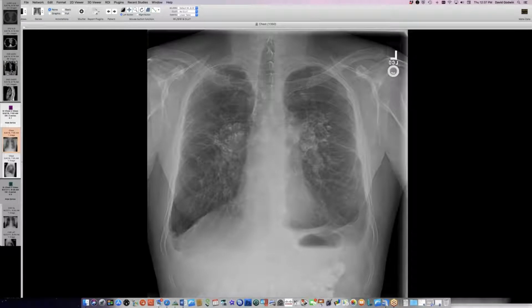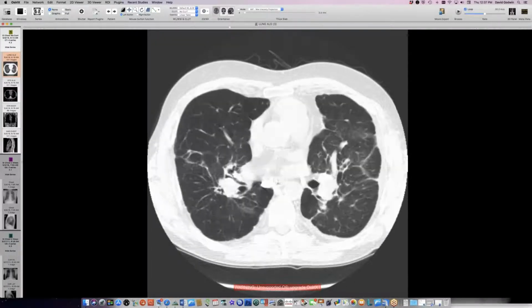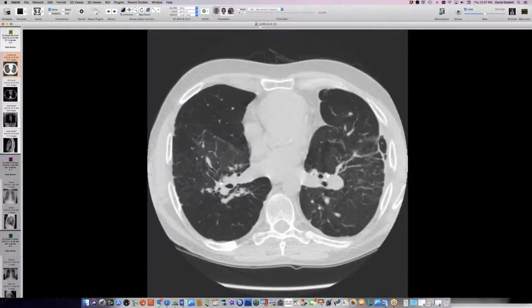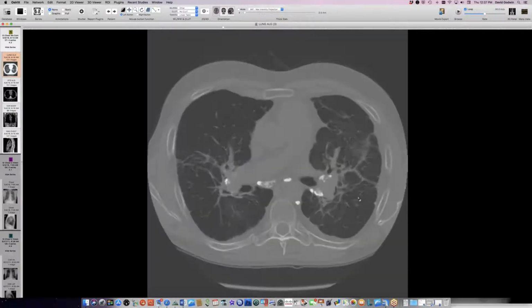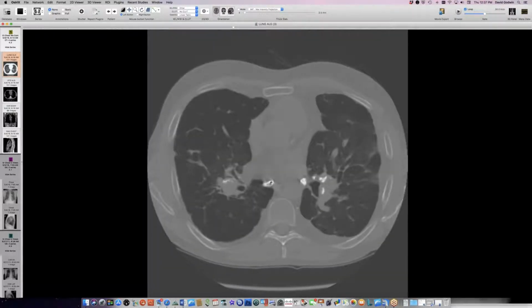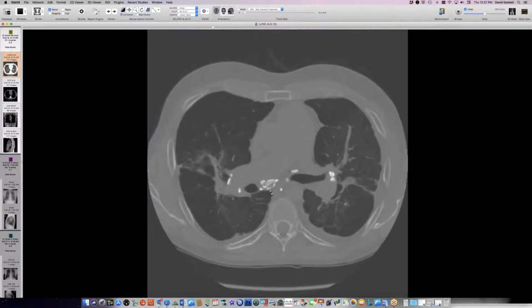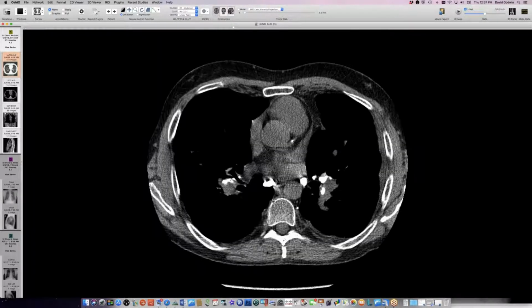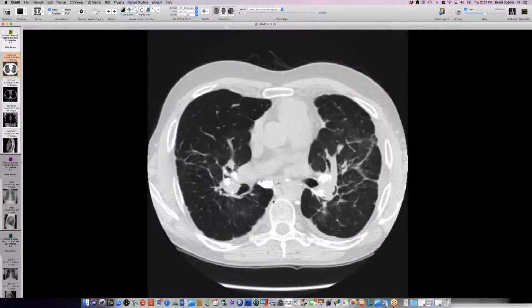And then lots of calcified lymph nodes with some eggshell calcification and lots of pleural thickening here. And here's what current CT looks like. This person, lots of distortion, these big perihilar blobs of tissue here, lots of calcium. So stage 4 sarcoid with a kind of PMF pattern, with the central scarring. And then we can bring out the calcification along the outer edge of many of these lymph nodes. Some of them are central for the calcium, but some of them are nicely peripheral, a la eggshell. And pleural thickening here, not pleural effusion. So two cases of sarcoid.